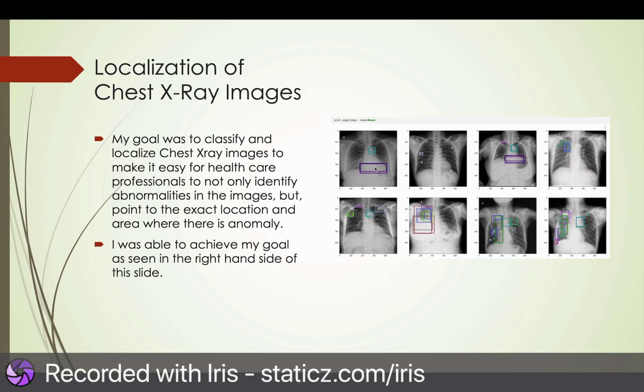And when you see more than one line of this kind, it seems like the radiologist, or different radiologists, were able to identify these two abnormalities. So that adds more value. That gives more confidence that if more than one person was able to identify the same, then it means for sure your model also has more accuracy.